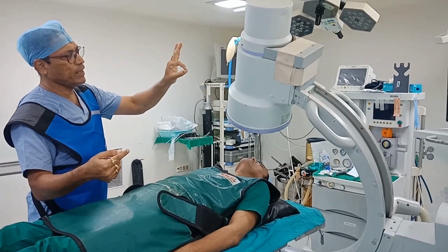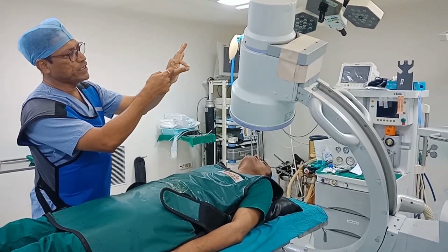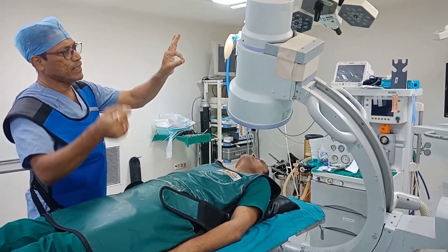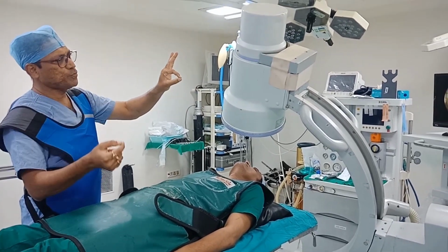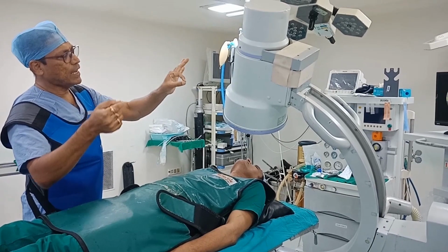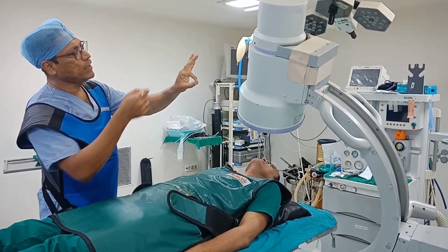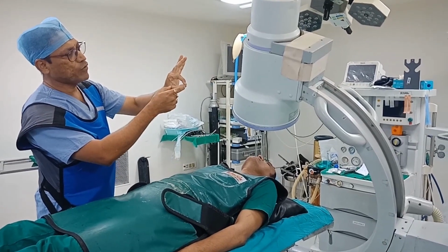If you are watching from here, the ovality will be less. So you can compare at which position I am getting the maximum oval foramen ovale, so that you get the maximum space to enter into it.